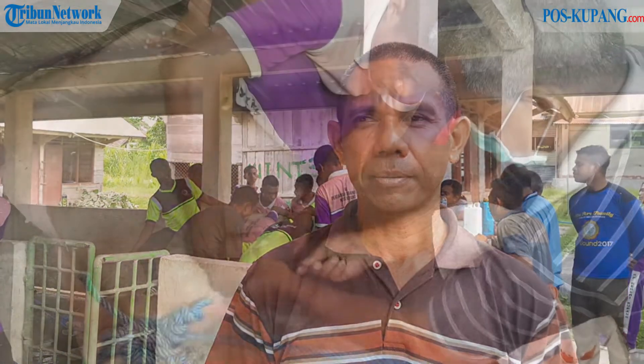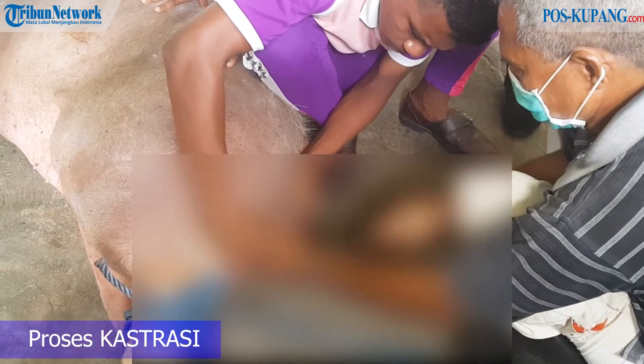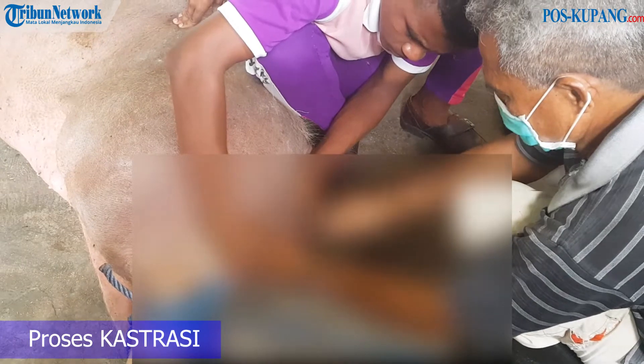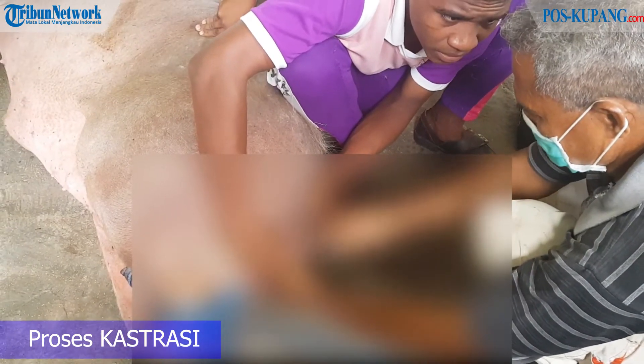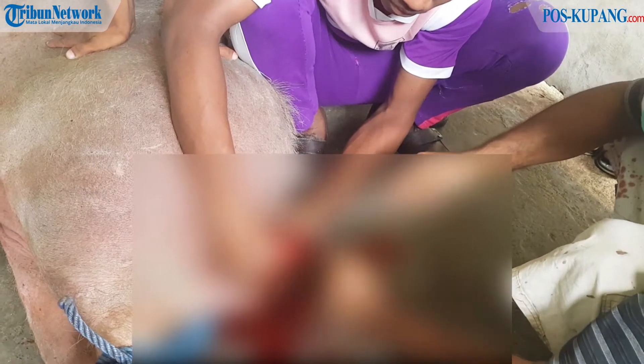Pagi ini kita mengkastrasi seekor babi jantan yang sudah dikatakan afkir karena tidak menghasilkan sperma yang bagus, sehingga pagi ini kita melakukan kastrasi dalam pengeluaran testis. Tujuan yang kedua bahwa dengan adanya kastrasi itu bisa menimbulkan dan menghasilkan kualitas daging yang bagus ketika dikonsumsi.